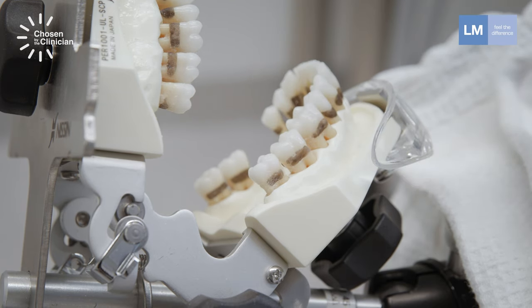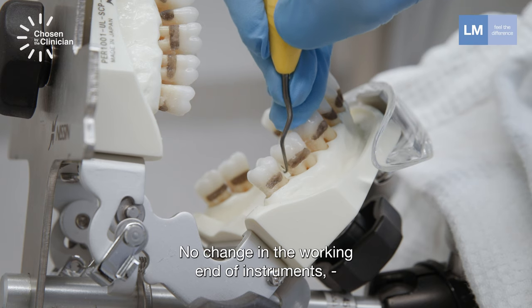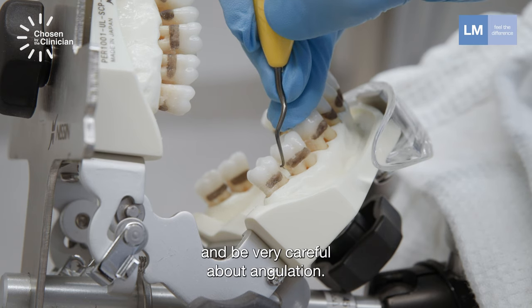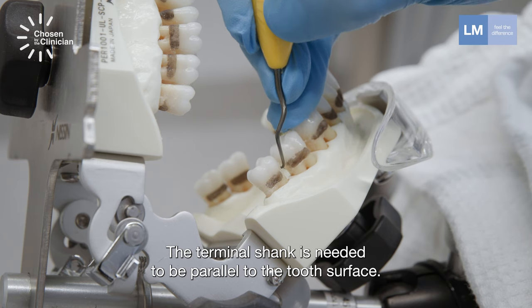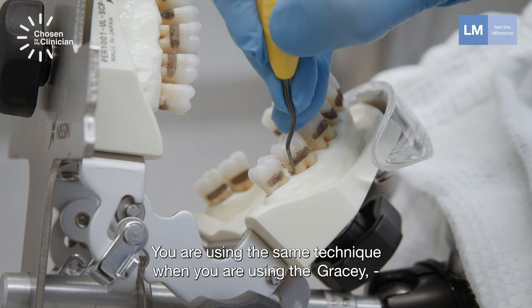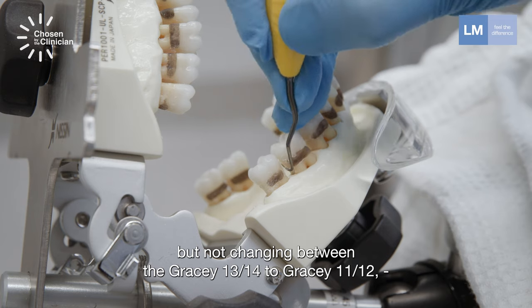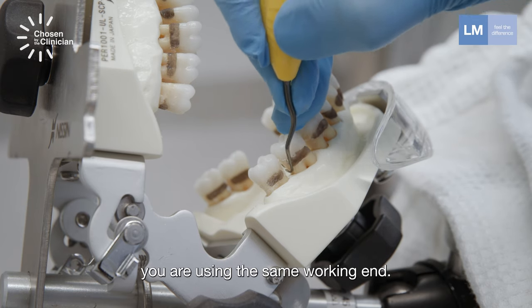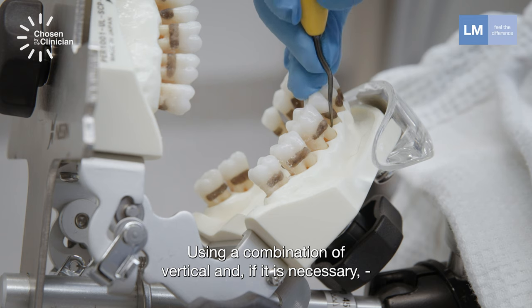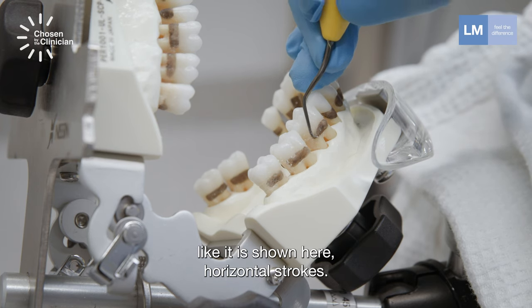Moving on to the mesial surfaces, not changing the working end of the instrument and being very careful about angulation. The terminal shank needs to be parallel to the tooth surface. You are using the same technique as when using the Gracey, but not changing between Gracey 13-14 and Gracey 11-12 — you are using the same working end, using a combination of vertical and, if necessary, horizontal strokes.